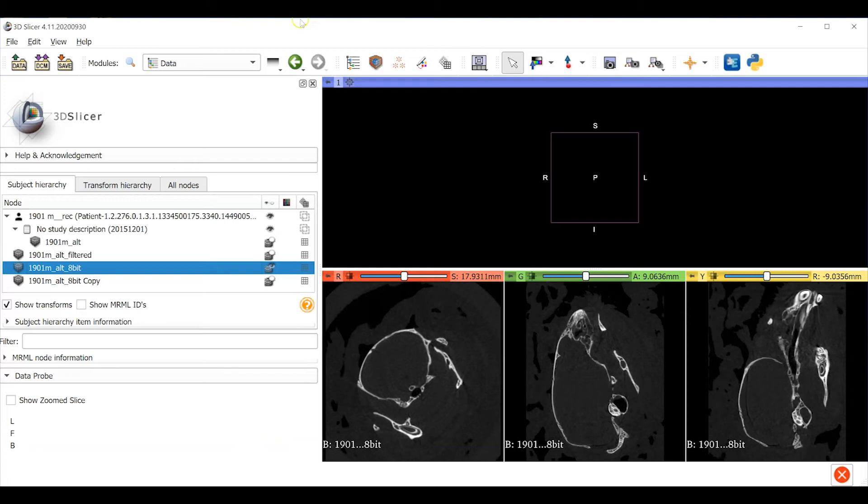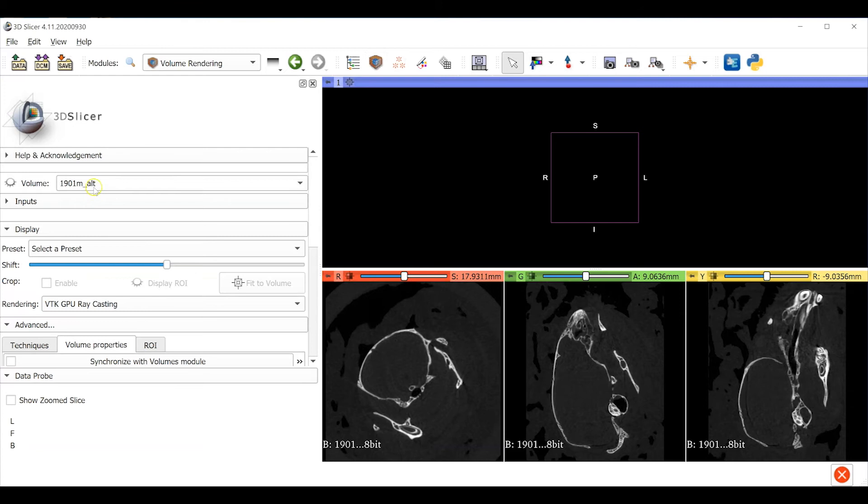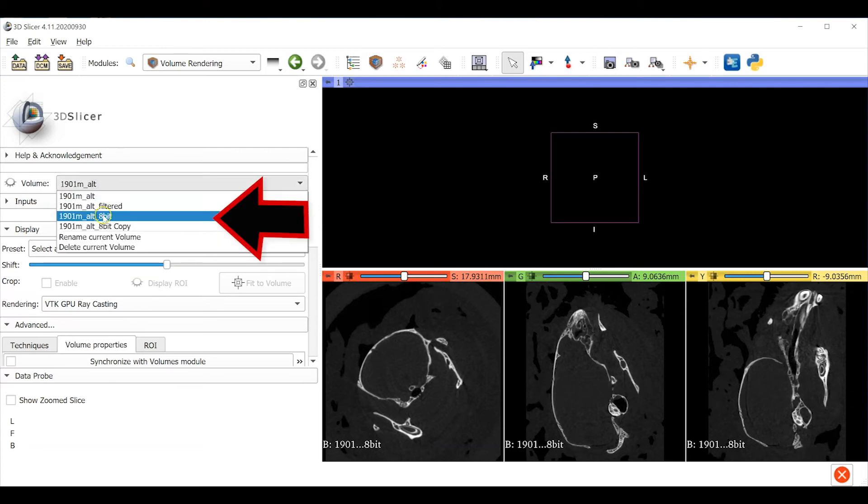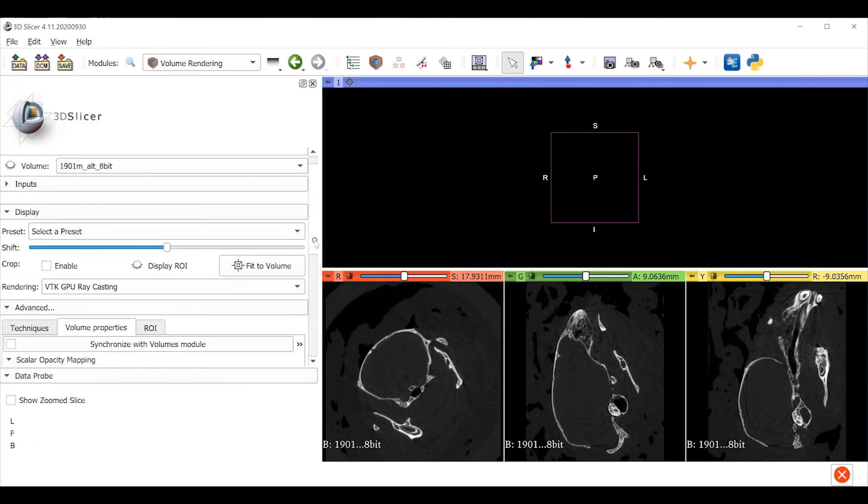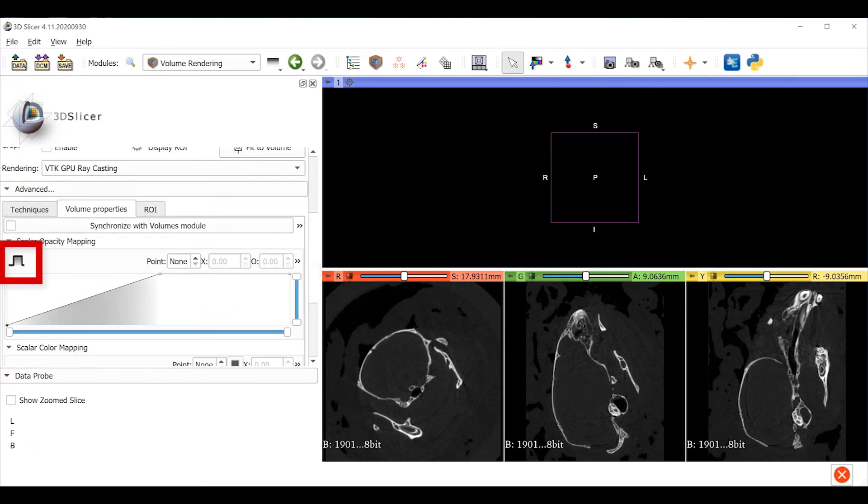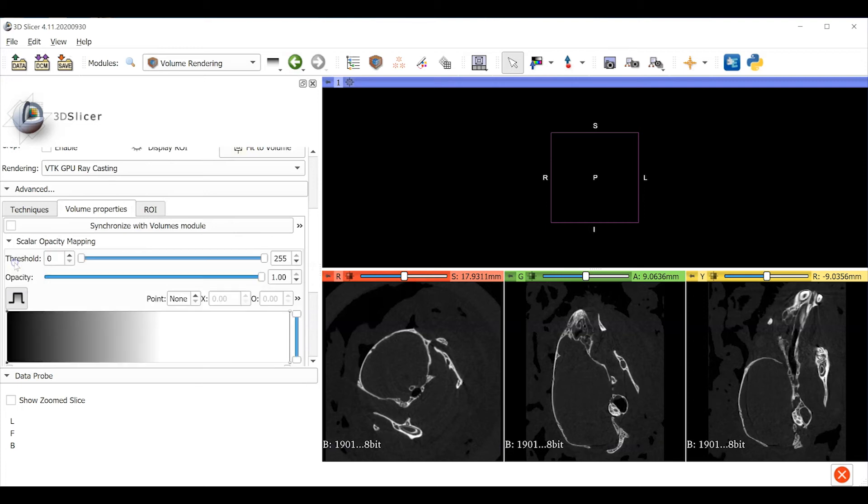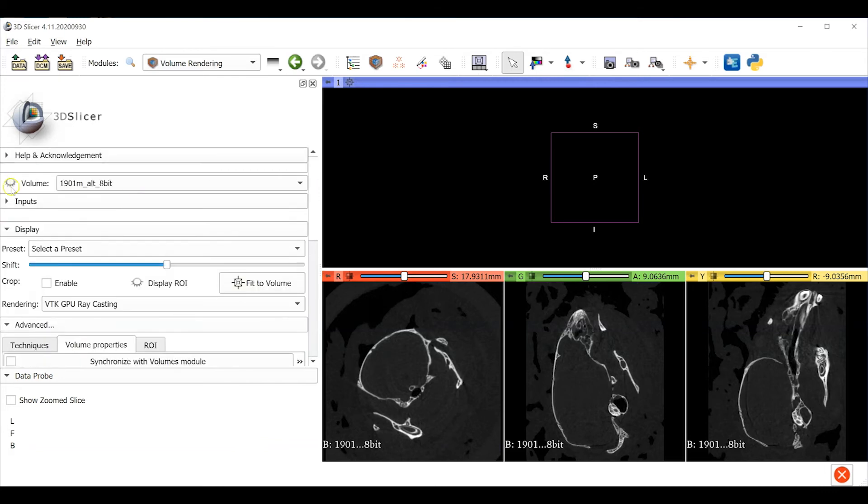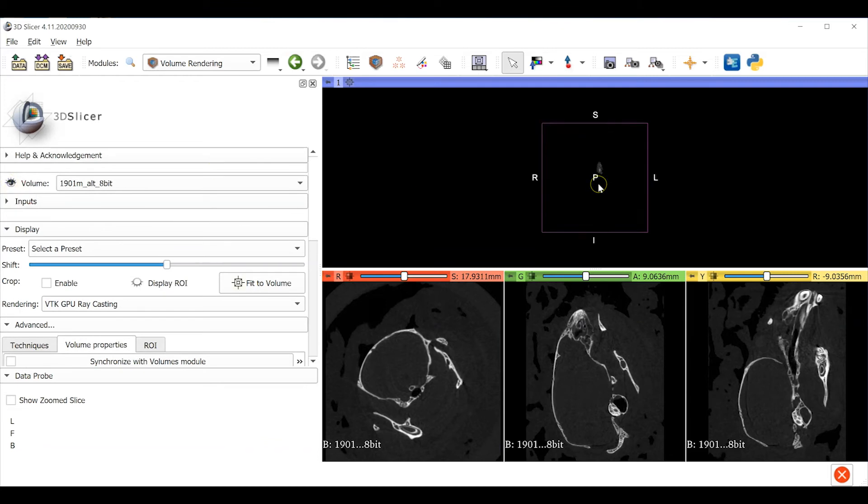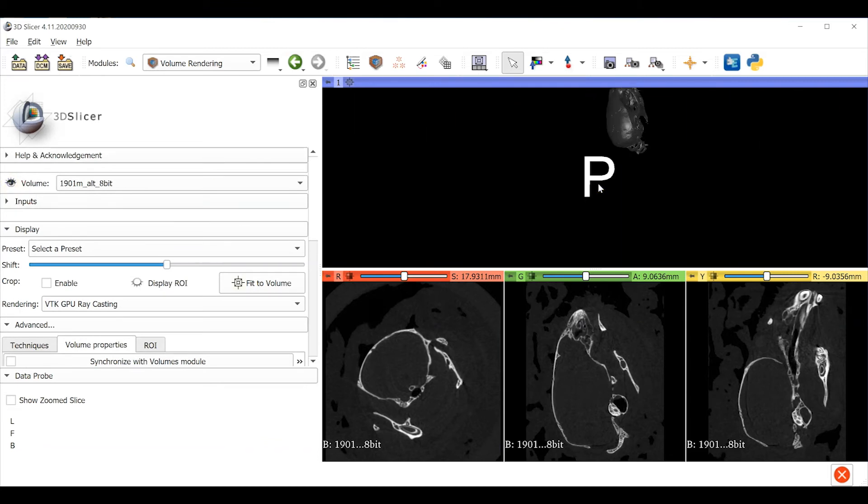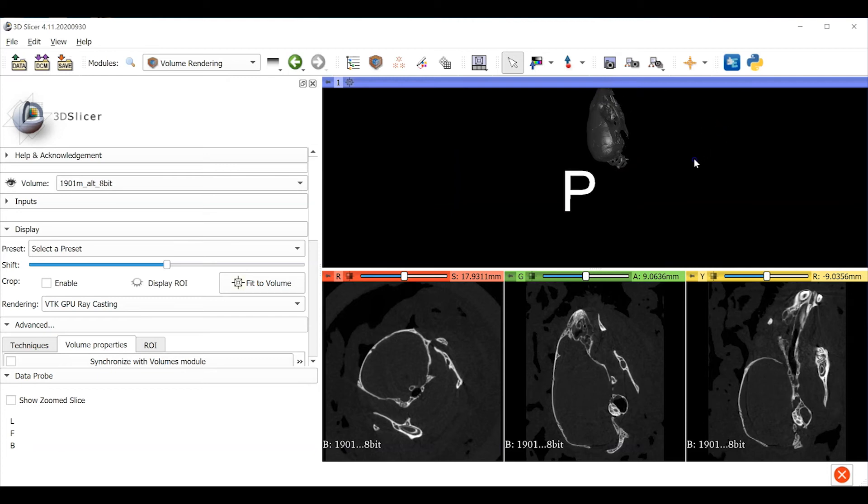Now visualize the 8-bit data using the volume render module. Make sure to set the volume as the new 8-bit data. Under the advanced menu click the histogram icon and set the minimum threshold for bone density. Now here where we've changed the grayscale values a threshold of 30 is going to be more appropriate. Toggle the eye on to show the volume rendering. And just like last time it appears small in this window so we'll have to zoom in.